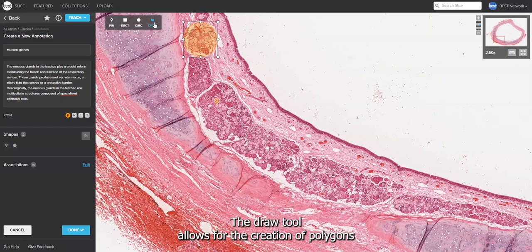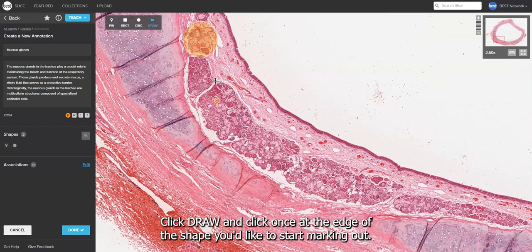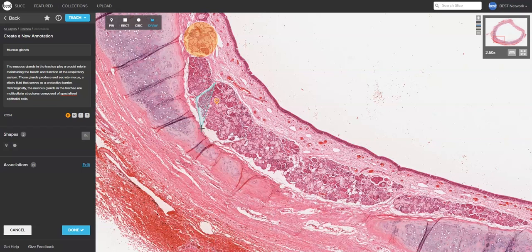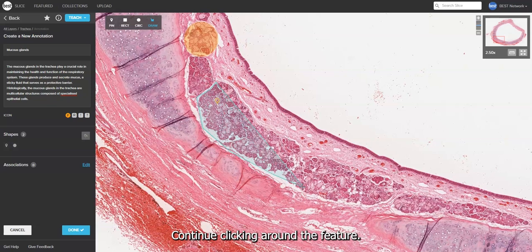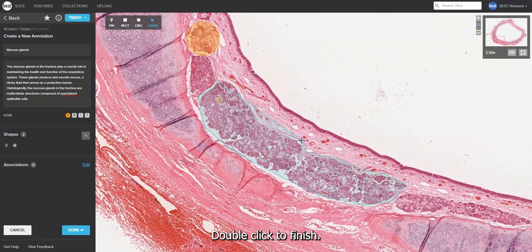The draw tool allows for the creation of polygons and is perfect for more complex features. Click Draw and click once at the edge of the shape you'd like to start marking out. Continue clicking around the feature, then double click to finish.